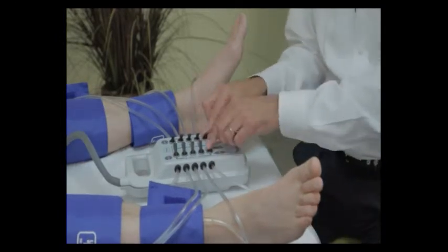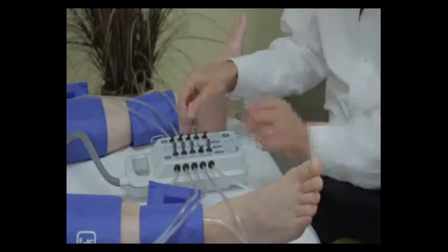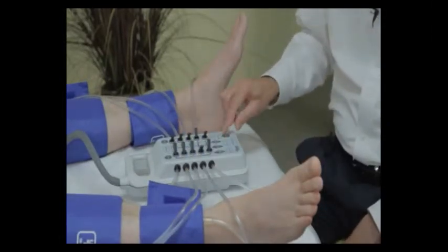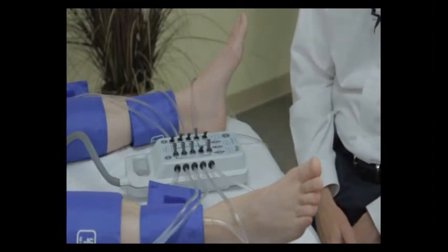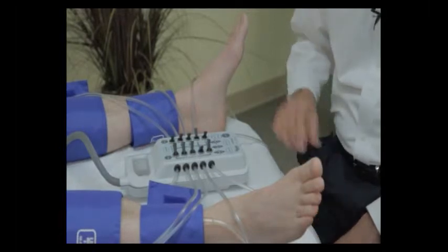I'm now going to close these, open the calf cuffs, and take my waveform at that site. Now that my waveforms are scrolling, I'm going to capture and scroll it to my liking.